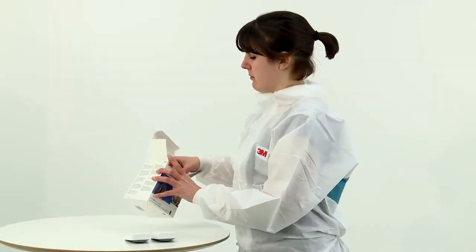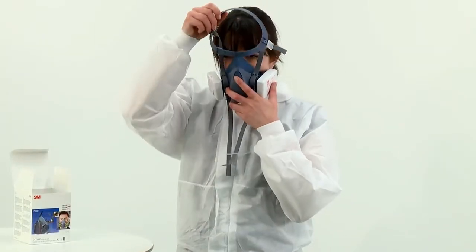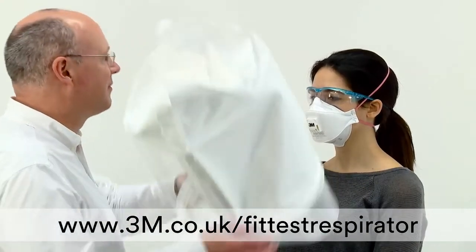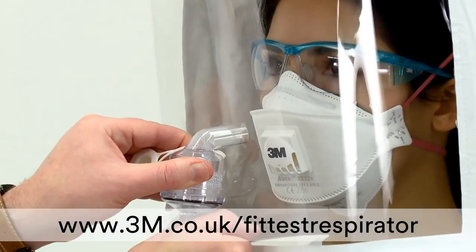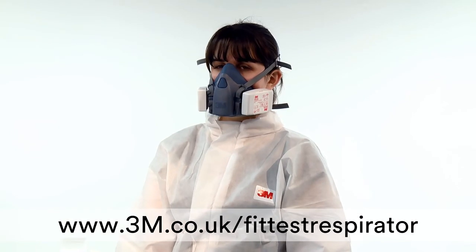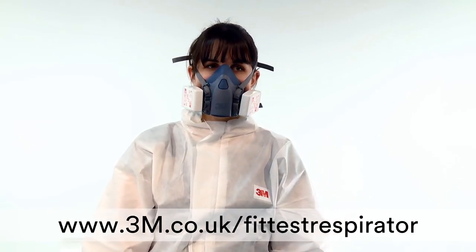The performance of your respirator relies on an adequate seal between the respirator and your face to ensure contaminated air does not leak in. The method of measuring whether or not you have an adequate seal is to pass a face fit test. Fit testing should not be confused with pre-use fit check, which should be conducted every time you use your respirator. For more information on fit testing, please visit www.3m.co.uk/fit-test-respirator.